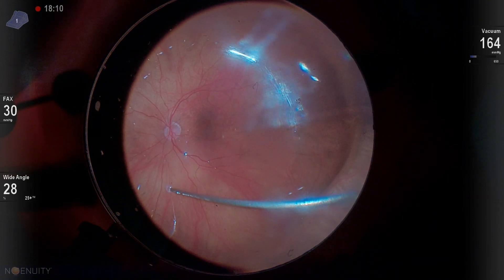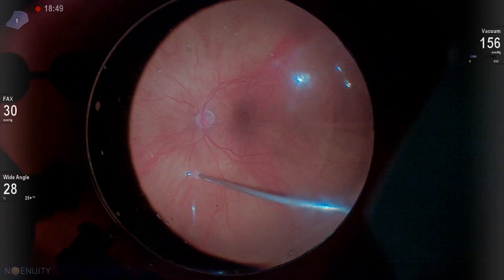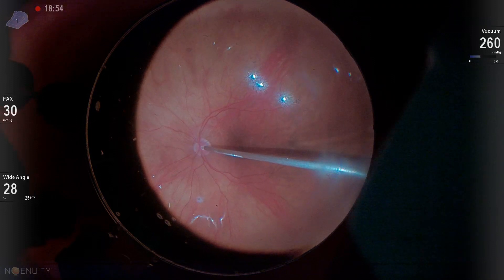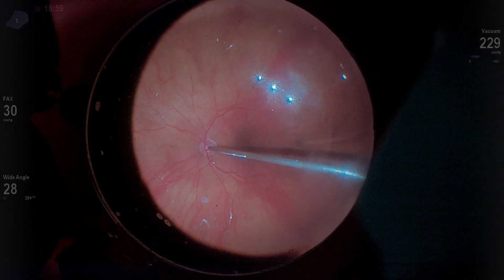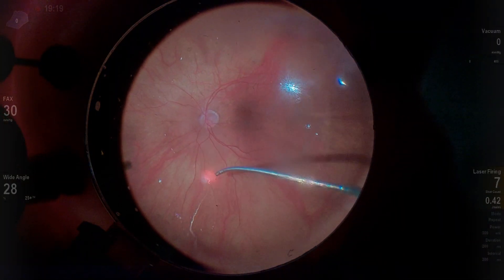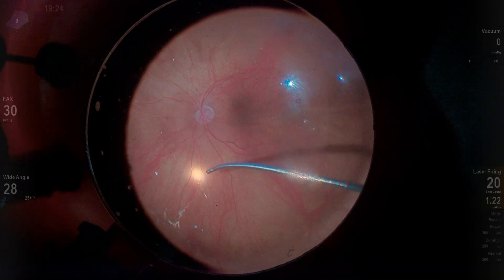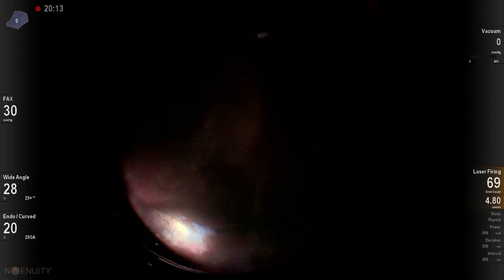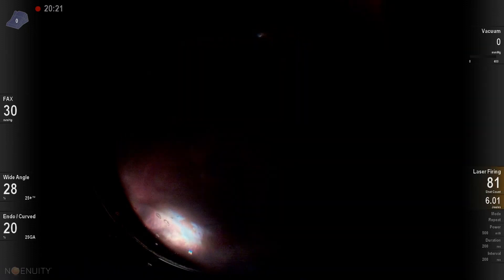I do it really slow — that's the key to getting the retina completely reattached and not having persistent subretinal fluid. Really roll that eye towards your drain site and very slowly aspirate the fluid through the drain site with the soft tip cannula, removing any residual fluid over the optic nerve. Since the retina is flat around my draining retinotomy, I'm going to laser it first, as that tends to be one of the areas that reaccumulates fluid the quickest. In this case, it was completely attached.